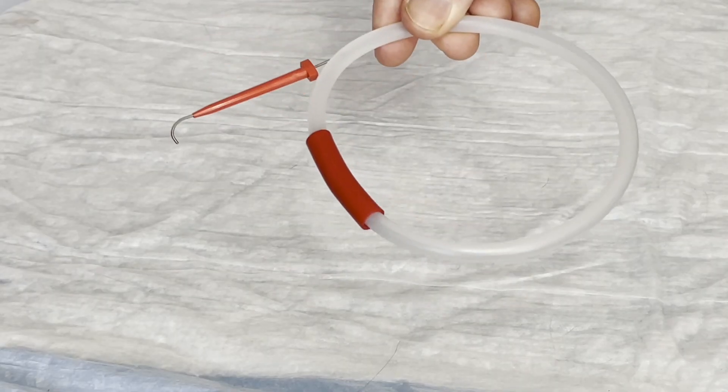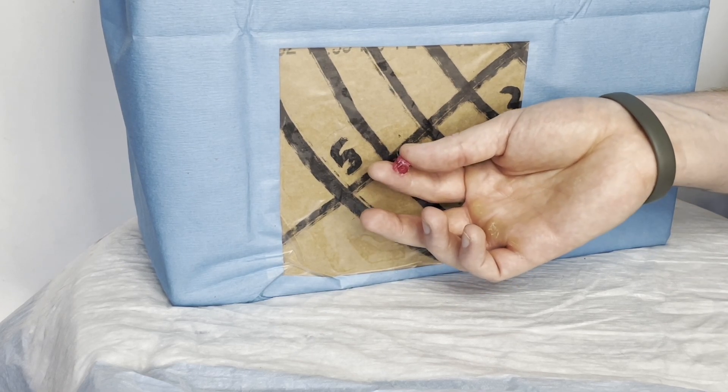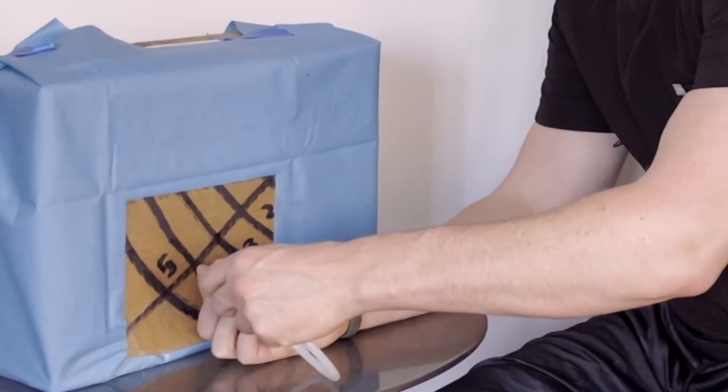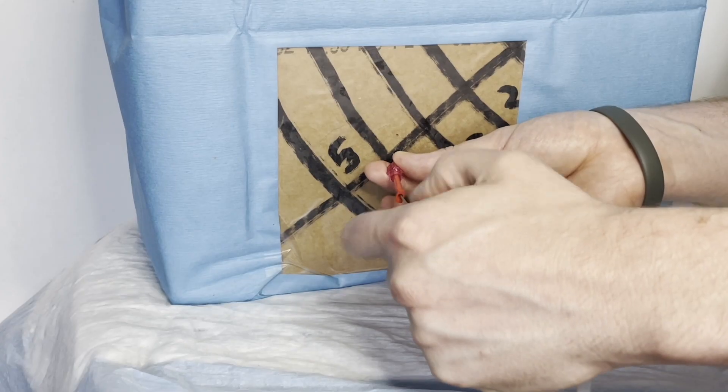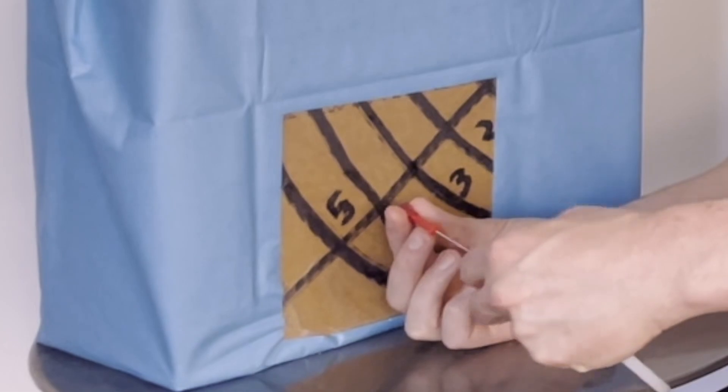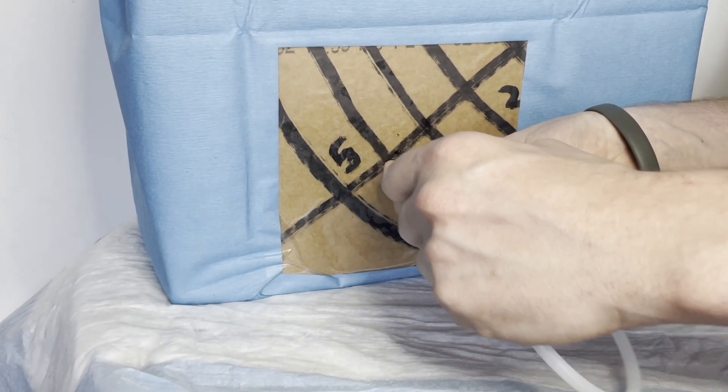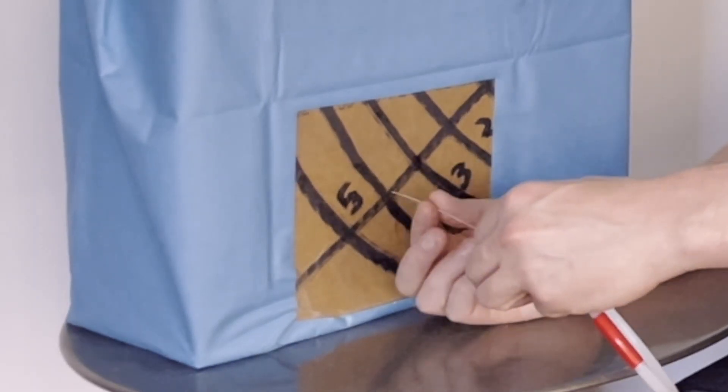As soon as we do that, we're going to grab a hold of the needle and then we're going to have our guide wire. And we're going to shift our needle just to cephalad and we're going to put our guide wire into the chest cavity. Now that we're far enough in, we can retract our introducer needle. And now we're left with the guide wire.